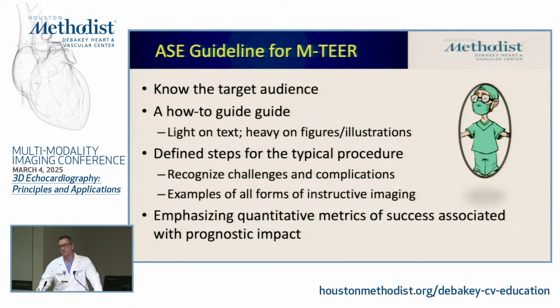We have the new TE probe, so it's, well, sorry, the pediatric. They call it pediatric, but really it's for structural. But the probe is smaller, we've seen it. I don't know that we need it for structural, frankly. I'll just tell you that one of the issues with probes and what limits them from getting really small, like an ICE catheter, is actually the coolant effect. There's a lot of energy, a lot of heat. So it's actually the radiator function of keeping the tip cold that limits getting them smaller.